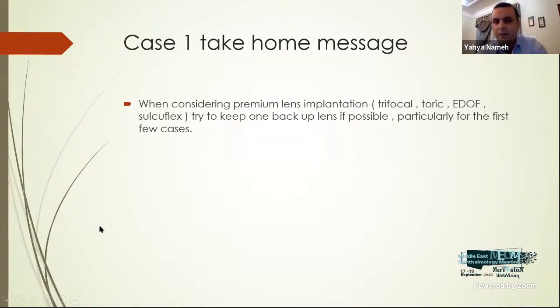The take-home message from this case: when considering premium lens implantation, the trifocal toric, EDOF or Sulcoflex, try to keep one lens as a backup lens, if possible, particularly for the first few cases, if you are not familiar with the new lenses like the Sulcoflex lens.